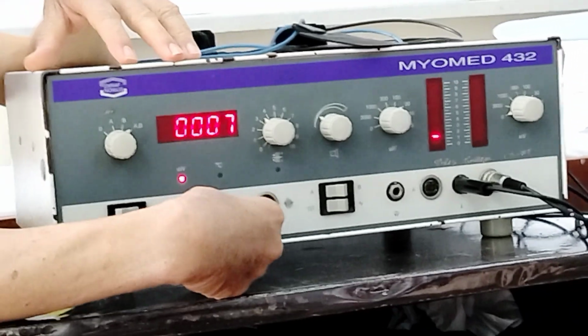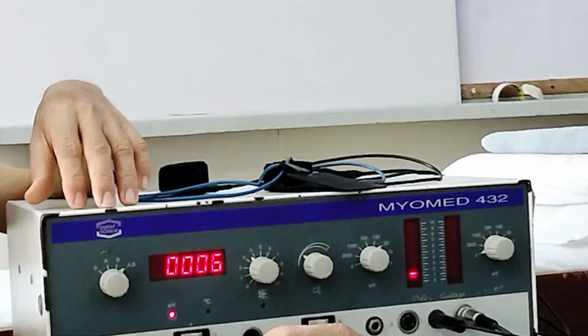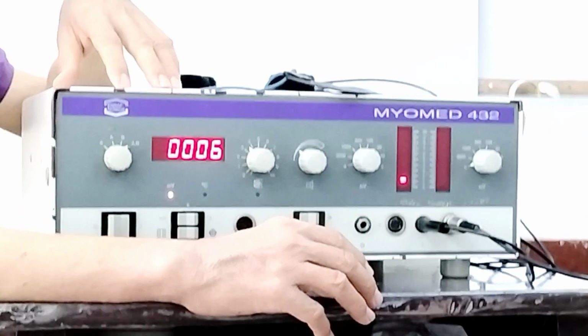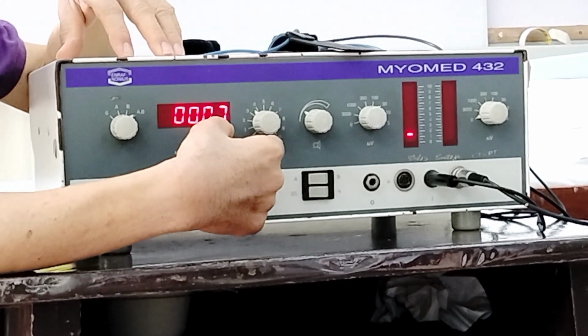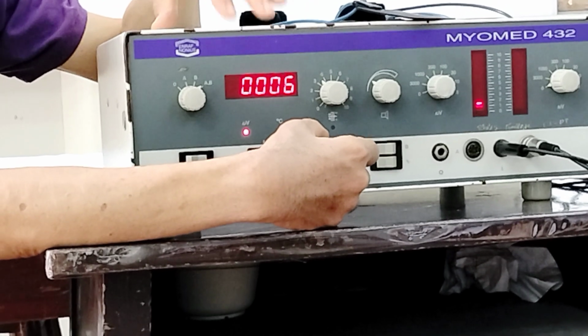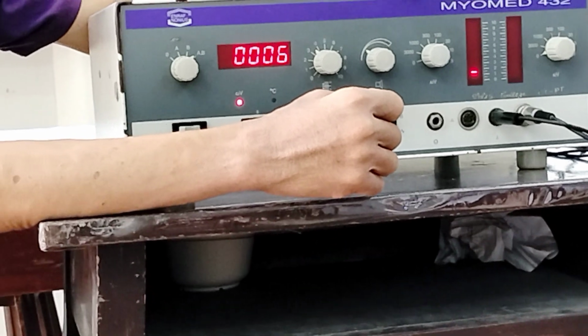So we usually use this 0.3 second if ever we want to enhance muscle contraction or action, so that the patient will further be encouraged to do the action. If the patient does the activity, the changes become faster, so the patient is encouraged to do more.